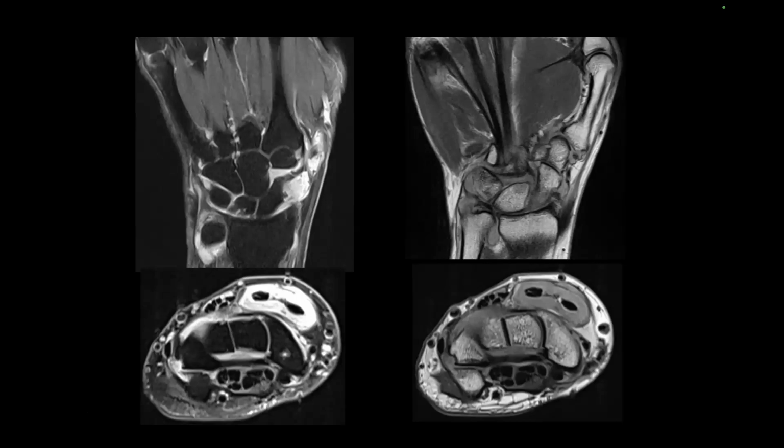So this was a case of a young patient who came in for query, I think, TFCC injury, and we can see that she's got a bulky synovitis across her carpus, so radiocarpal, her distal radioulnar joint, pre-ulnar styloid recess, and across the intercarpal row. And we can see that the joint effusion is not just a bland effusion, it's got this low grey level signal within it. And we can also see that there is quite a bulky tenosynovitis of one of her extensor compartment tendon groups.